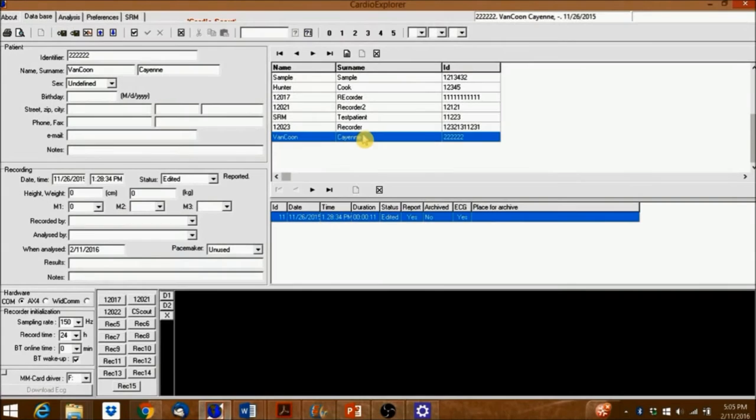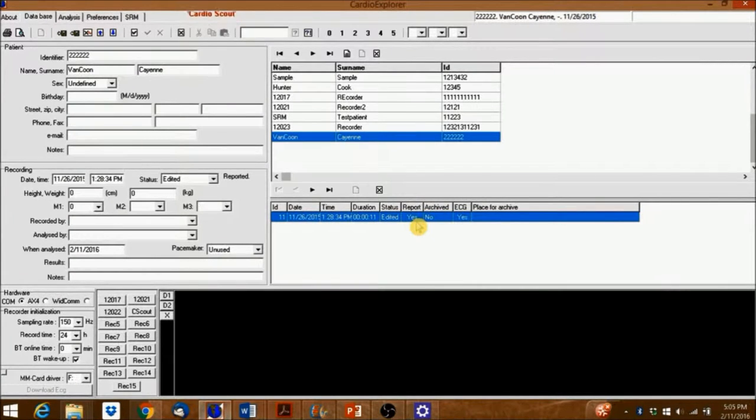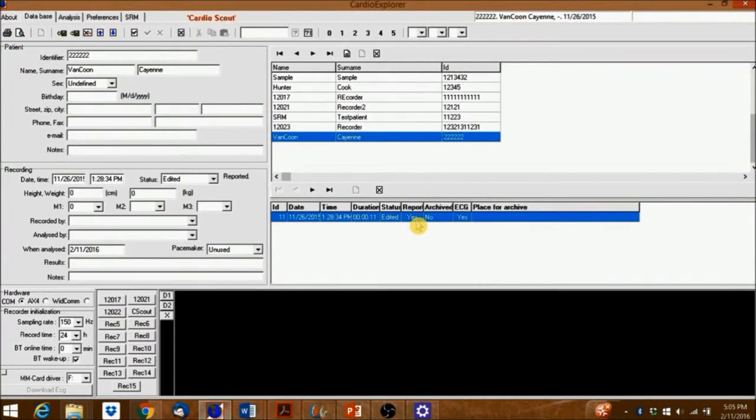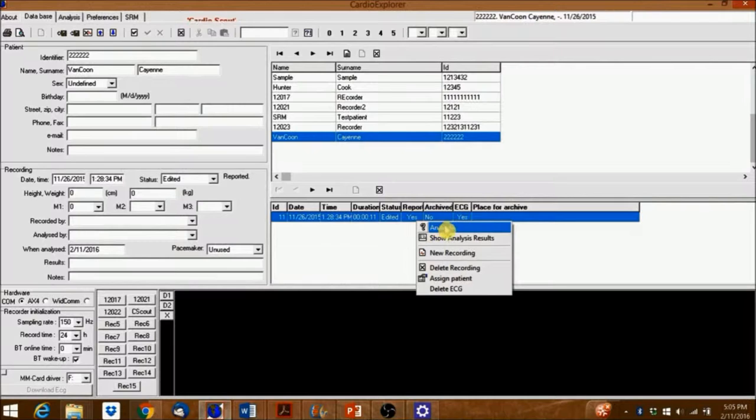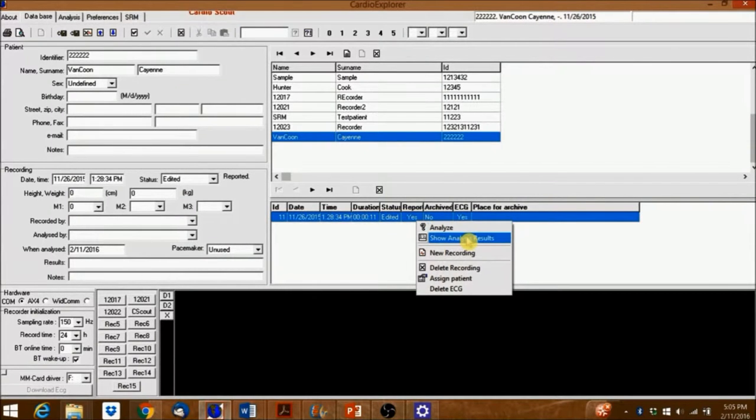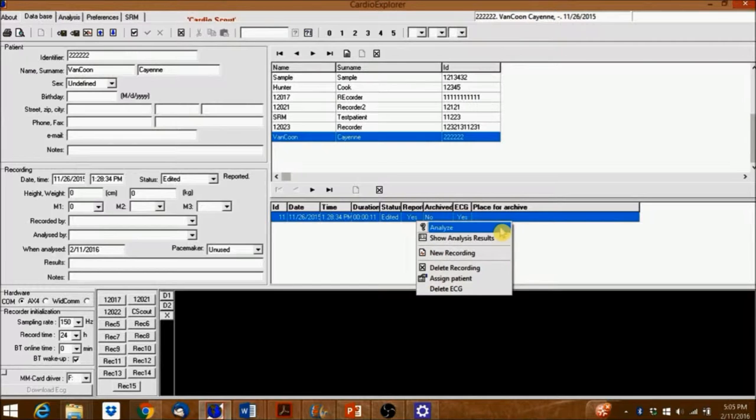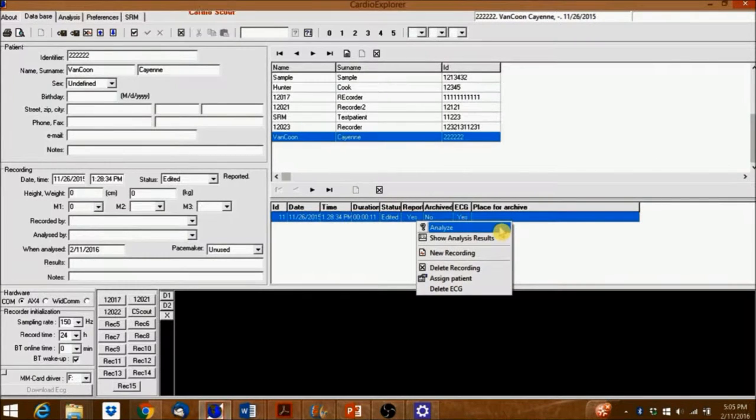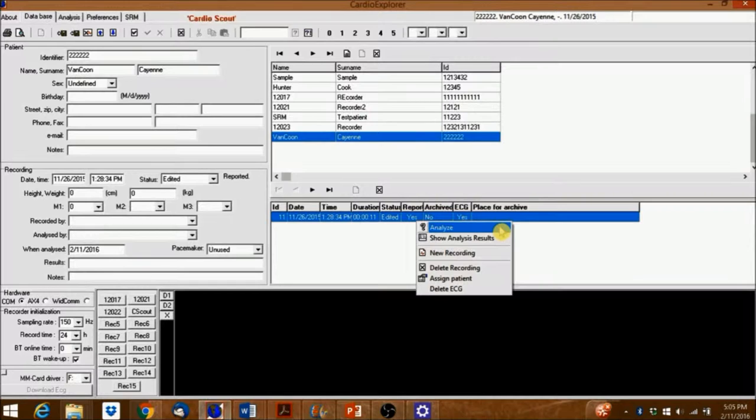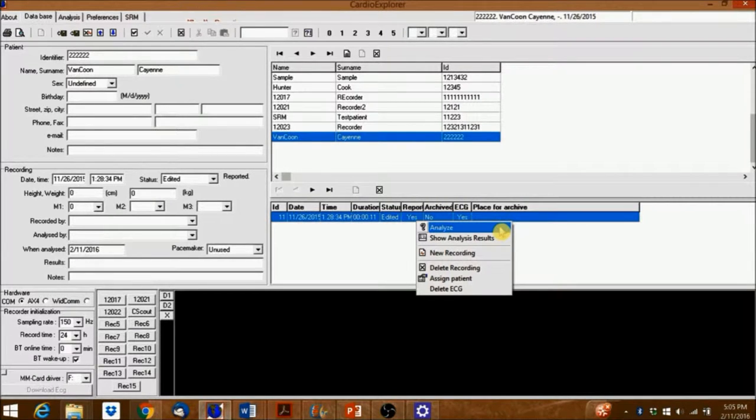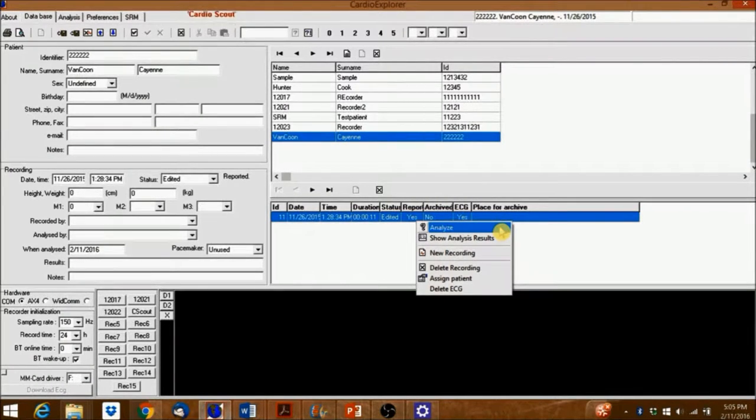First, select the patient whose ECG recording you wish to analyze. Analyze will begin a new analysis session, overriding any previous analysis, and Show Analysis will let you continue a saved, finished, or work-in-progress analysis. Let's click Analyze.